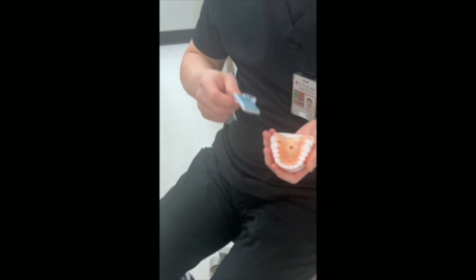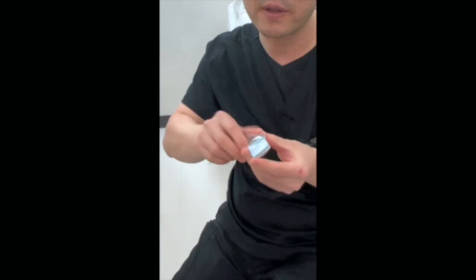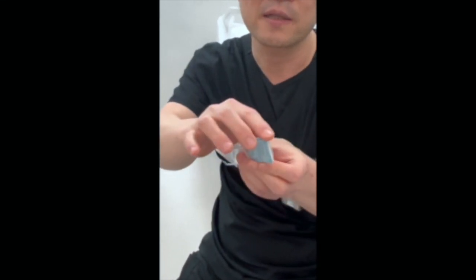Today we'll be examining how to take a periapical radiograph for endodontic treatment. First thing you want to think about is the sensor. It's very high quality. However, it is a very stiff sensor. It's not flexible. It's not the same sensor that we use in urgent care or on the second floor. Just remember the sensor is very stiff. When you look at the corner, it can also hurt the mouth. So it's important to recognize that when placing it for patients.